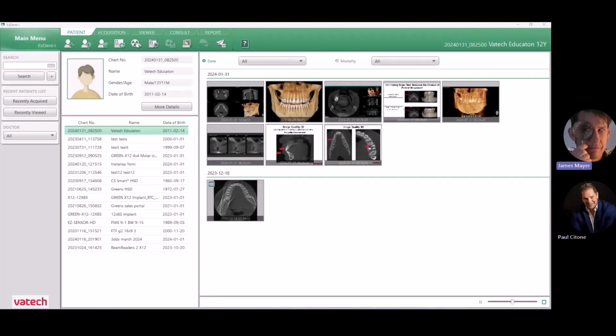So Paul, we just went through patient positioning on the cone beam here, and I think it's important to do a little bit of talking about CT image quality and evaluation. Would you agree? Yeah, absolutely. Taking a look at your images immediately after you take them is a great idea to verify you captured the proper anatomy and making sure everything looks the way it should.